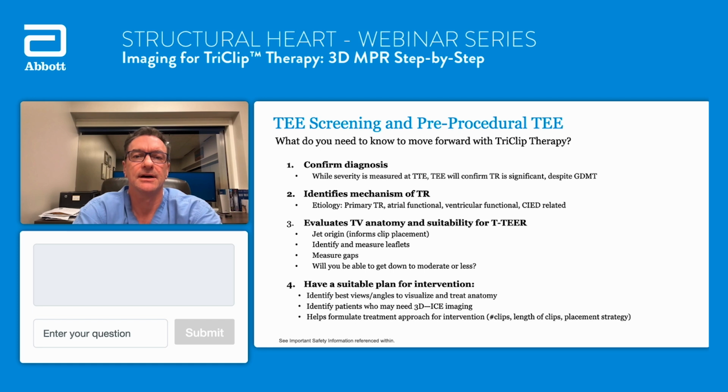Patients with left heart prostheses, patients with significant calcium of the aortic or mitral valves, patients with implantable electronic devices often will need ICE. Or sometimes we are anticipating multiple TriClips being deployed, and sometimes ICE will be very helpful in those scenarios. So when you've considered all of that, you formulate a treatment approach to the intervention, anticipating the number of clips and where they'll go.